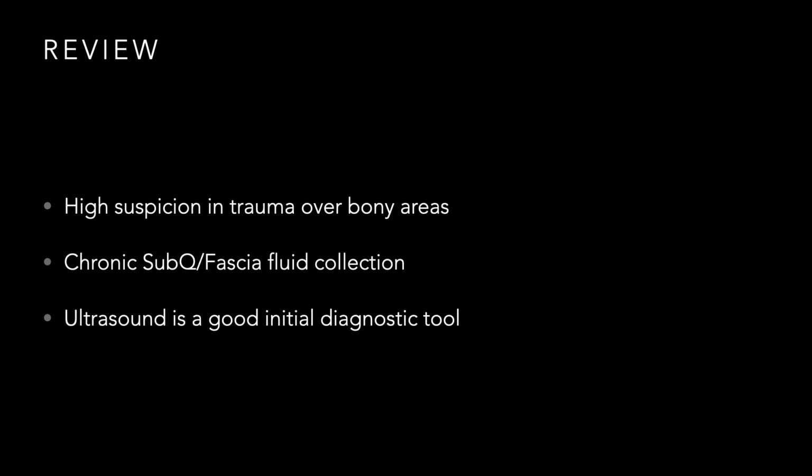But just to recap a little bit, Morel-Lavallée lesions are lesions that happen as a result of trauma, right? So you should be suspicious of it in cases with trauma that have direct impact or a shearing impact, particularly to these bony protuberances, most notably around the torso, the pelvic area, the greater trochanters, right? They are essentially a fluid collection in between the subcutaneous layer and the fascia that can become chronic, right? And can cause a bunch of downstream complications in terms of that wound and that healing.